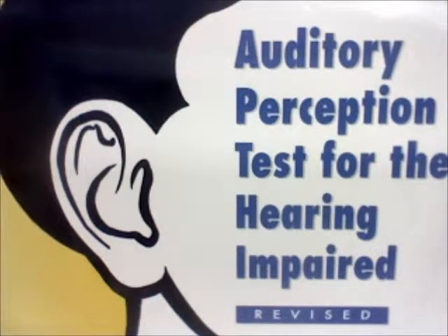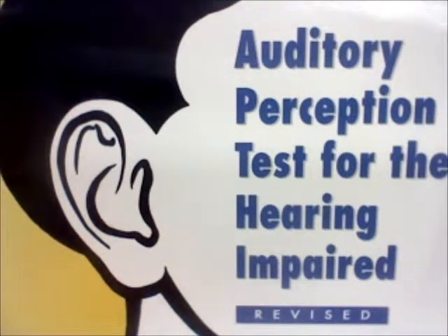The following subtests are given: auditory awareness tasks, duration, intensity, and pitch identification tasks, prosodic perception tasks, vowel perception tasks, consonant perception tasks, other segmental perception tasks, linguistic perception tasks, and communicative comprehension tasks. Each of these subtests has a visual auditory and an auditory-only component, except for the final subtest. This subtest, the communicative comprehension task, is auditory only.